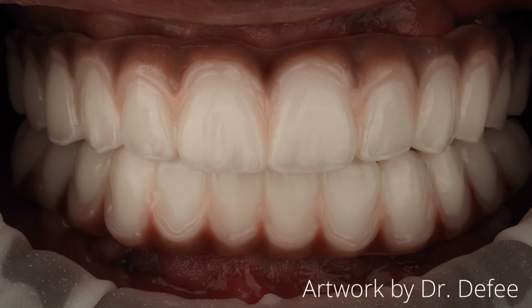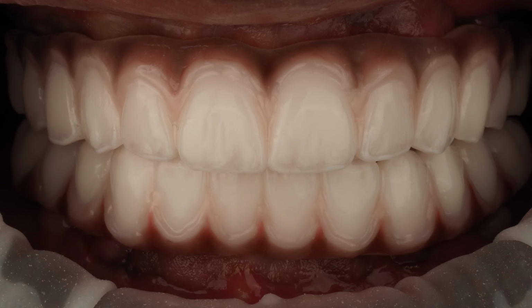And we're going to go ahead and just passively screw this. And look at this amazing artwork by Dr. Defee here. This is just incredible. Anyway, I hope this helps understand the process of what these are for and why we use them. And I think these are a game changer for those of you guys who have older scanners and have struggled scanning long parallel sided scan bodies.